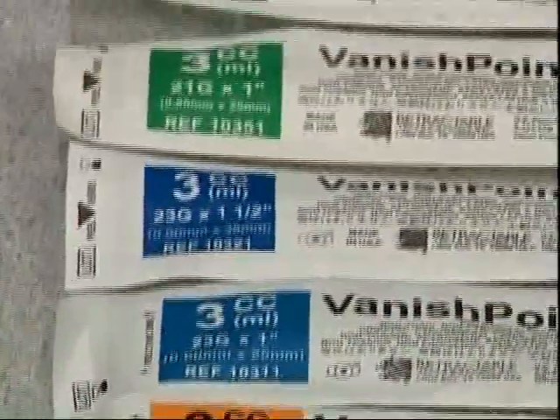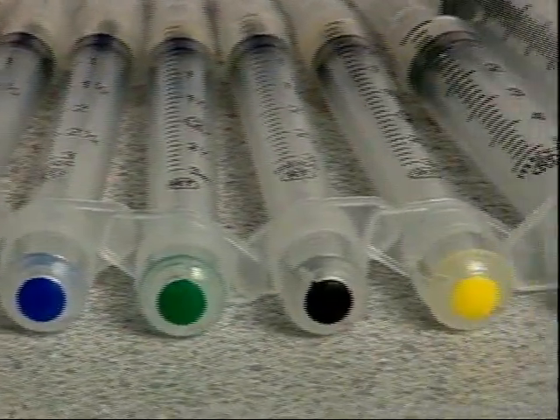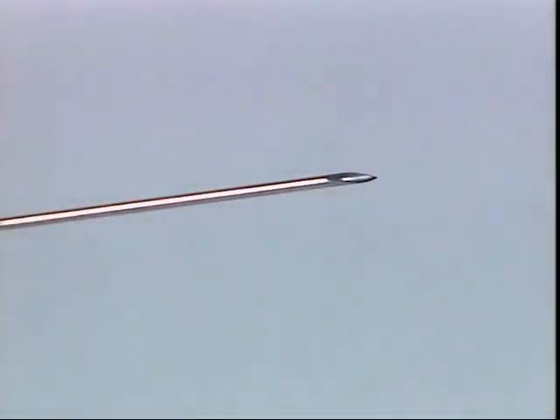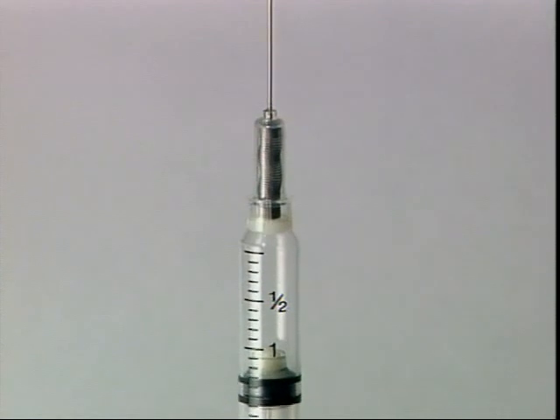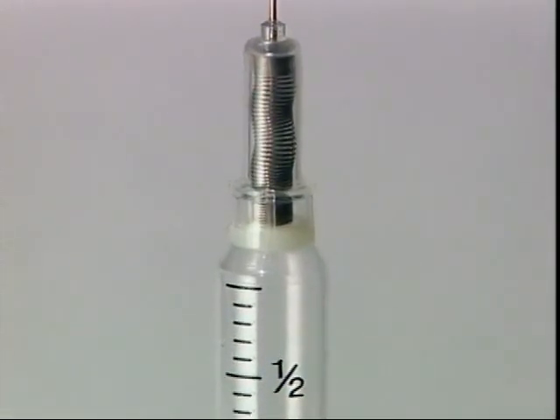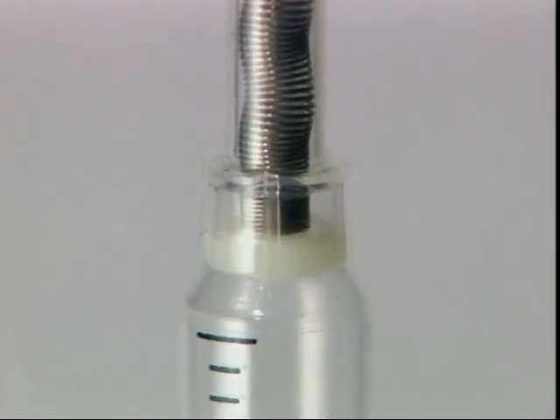VanishPoint syringes are color-coded for needle gauge using international standards for needle gauge color codes. All VanishPoint syringes have an attached triple-beveled needle for patient comfort and safety. VanishPoint's closed-system design prevents potential medication contamination and leakage. The unique hubless design reduces the amount of dead space or medication left in the syringe after the injection is complete. VanishPoint syringes have less dead space than luer-fitting needle and syringe combinations.